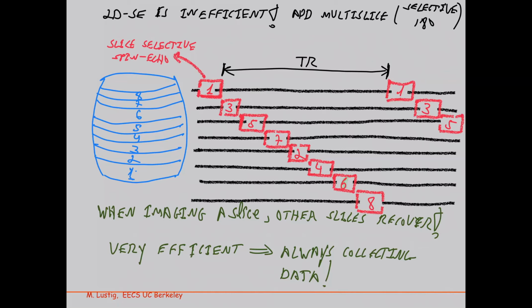And so the more RF you do, you're also exciting the spins in the protein pool. And because there's exchange with the water pool, that would reduce your signal next to protein. So your contrast may actually change when you do multi-slice, even though you don't mean to, because of that exchange that happens. So this effect is called the MT effect in multi-slice spin echo, which could be a problem, and that can also limit the number of slices that you do. But that's again beyond this class.